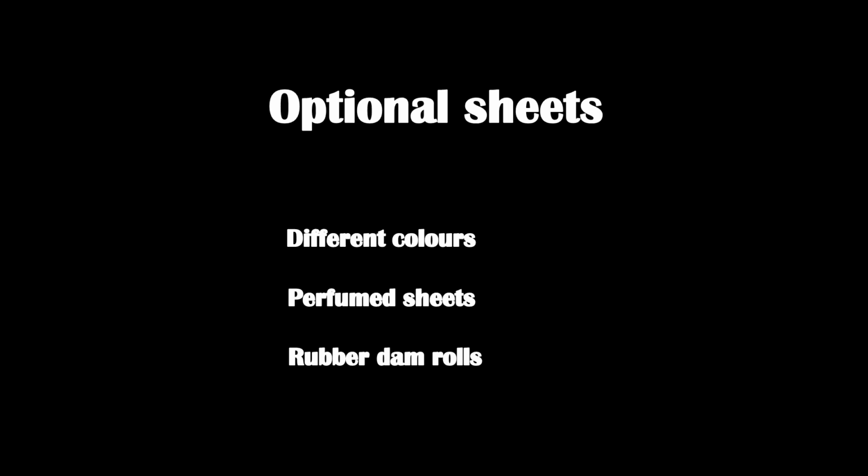Perfumed sheets in pleasant perfumes like mint and other flavors are sometimes acceptable to patients, and they actually are very comfortable with that kind of gentle, pleasant smell and flavor. But there are some who may take objection to it also. So it is important for us to decide how many you want to have or whether you want to have them in your armamentarium or not. Rubber dam rolls are no more available.